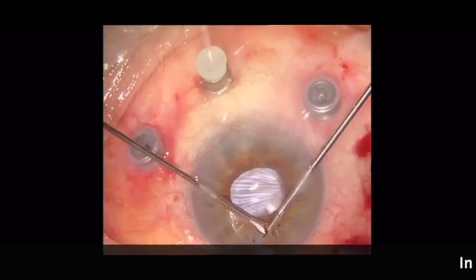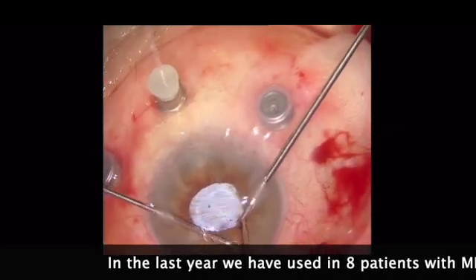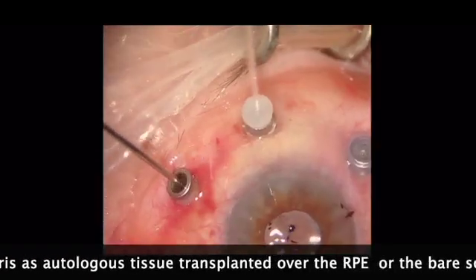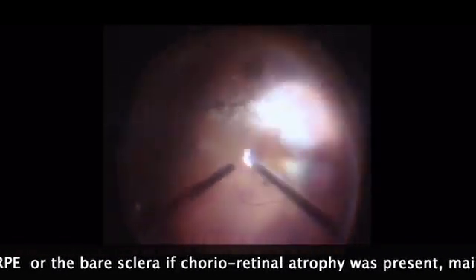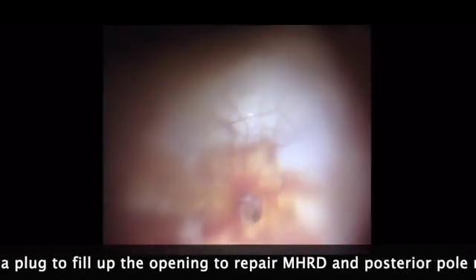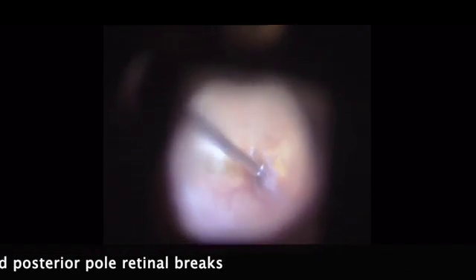In the last year, we have used, in 8 patients with macular hole retinal detachment, iris as autologous tissue transplanted over the RPE, or the bare sclera in case chorioretinal atrophy was present, mainly as a plug to fill up the opening and to repair macular hole retinal detachment and posterior pole retinal breaks.